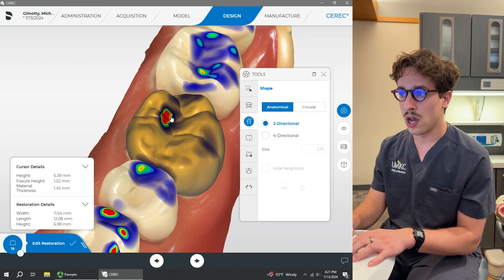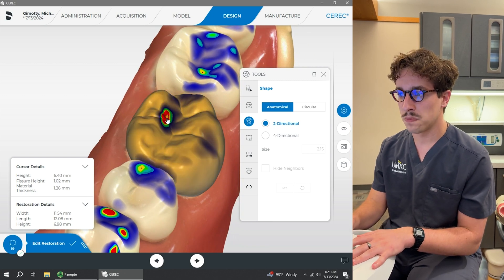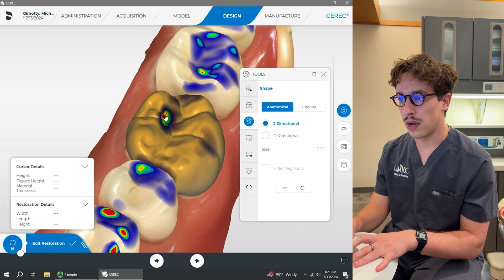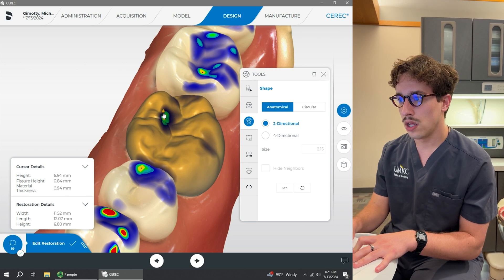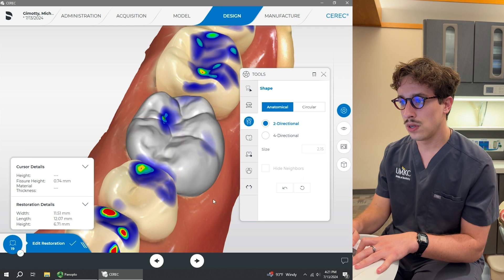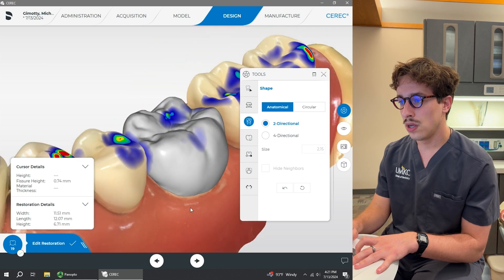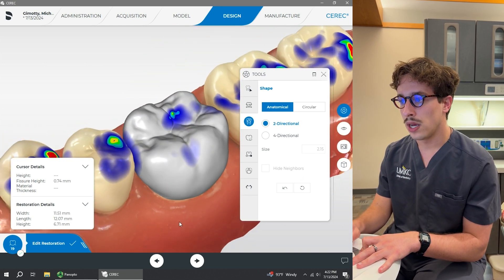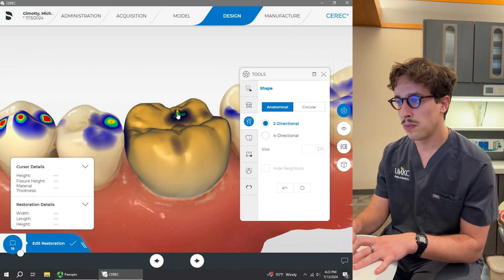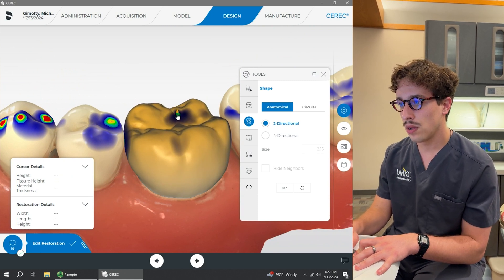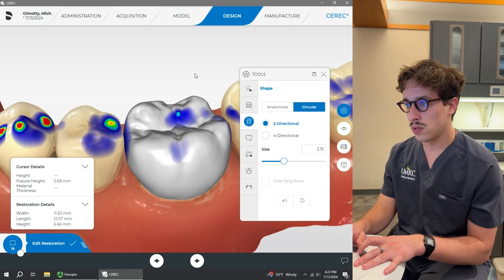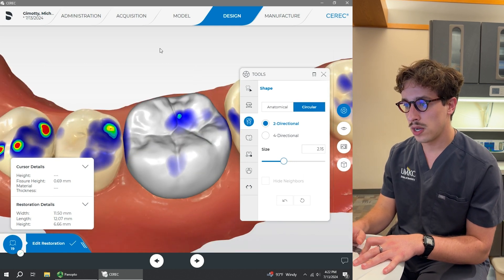What CEREC recommends is to reduce contacts down to kind of the light blue — the lightest blue, almost like a teal color — and maybe have a little bit of green, but no red and no yellow if you can avoid it. So I'm going to hover over this portion on the occlusal table, click on it, and just drag it down until we're there. Now I'm going to click on circular as well.